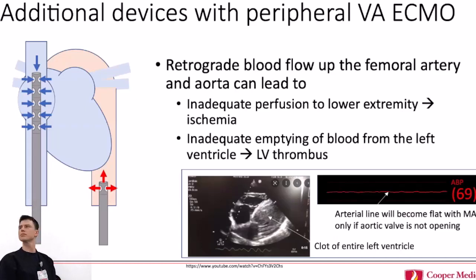But seeing it, and for these extreme cases, which we'll see more and more of, where you're basically completely flat, the first thing you'll see is ejection as the heart wakes up. And Dr. Gala talks about, you put anyone on ECMO, start all that flow against their LV, it's going to diminish the native cardiac function. Like when we had that patient in 5, he was looking at the waveforms, ejecting and not ejecting. I was actually having trouble seeing that nuance. But from the tracings and then looking with echo, I think you can start to figure it out.